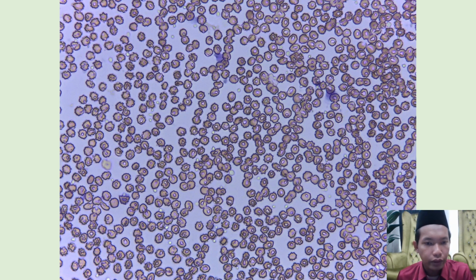And of course, the burst cells, the crenation cells, in massive number. Teardrop, maybe, no. I don't think so, because from the diagram we can see no teardrop. So that's all for diagram 4.